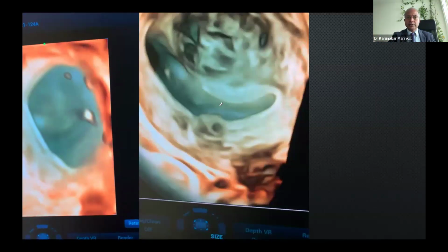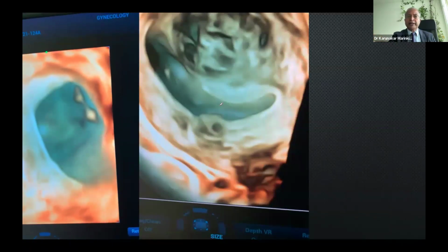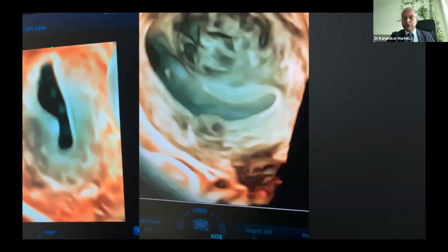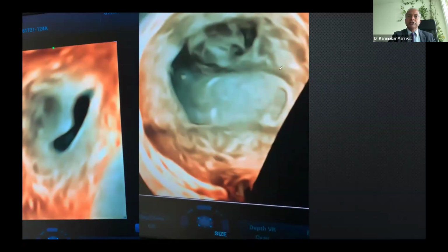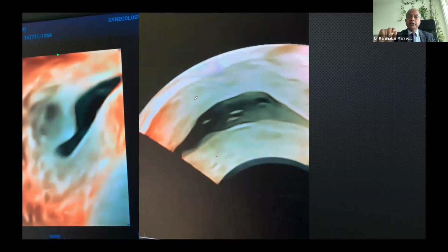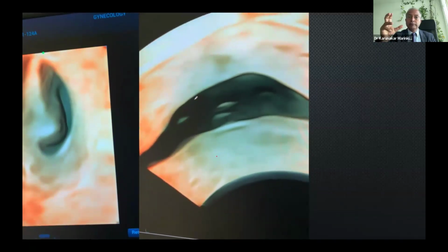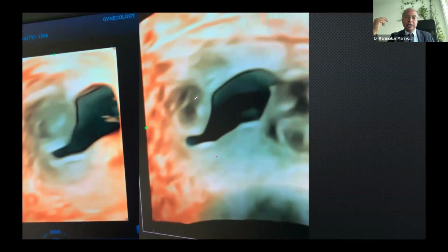And so, by sitting patiently with the patient, giving the pros and cons, risks and complications, extent of the myometrial damage, the expertise that you have, you need to take all the factors into account before you try to see the amount of invasion of the endometrium that the myometrial pathology is causing. So 3D is one of the useful techniques to decide which myometrial pathology needs removing after hysteroscopy. And after your myometrial surgery, you must establish implantation-friendly endometrium in the place where you removed the pathology. Until then, we are making a mockery of which fibroid to remove, which adenomyoma to remove, through the hysteroscope, through the laparoscope.